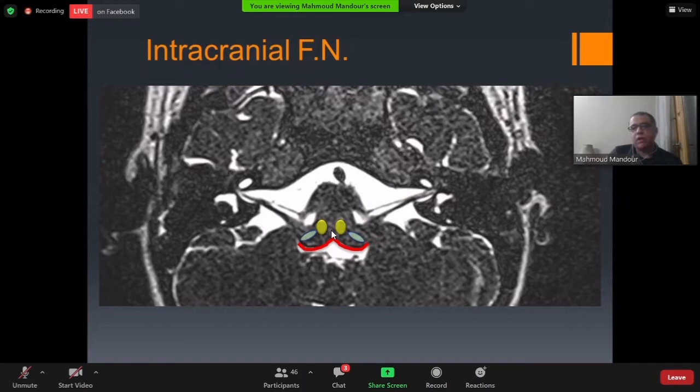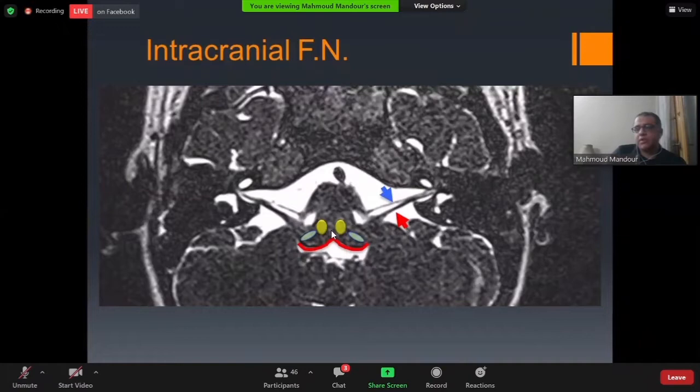At this site, two straight parallel structures pass through the cerebellopontine angle to the IAC. The anterior one (blue arrow) is the facial nerve; the posterior one (red arrow) is the vestibulocochlear nerve. Here you can evaluate the intracranial part of the facial nerve and roughly assess its integrity.